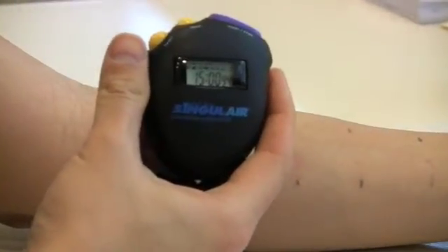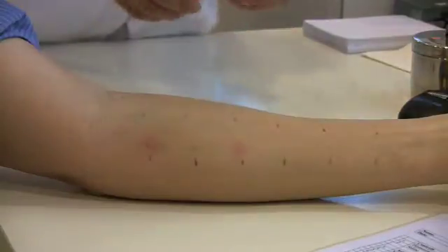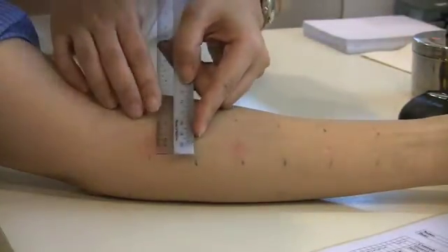The results can be read after 15 minutes. You can see here that there are two wheal and flare reactions. The first reaction is that of the histamine positive control.